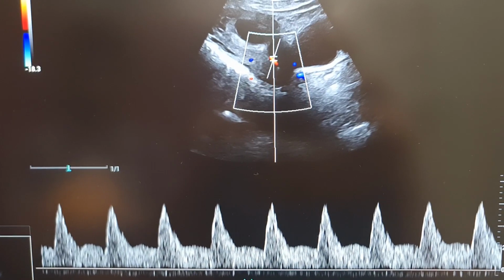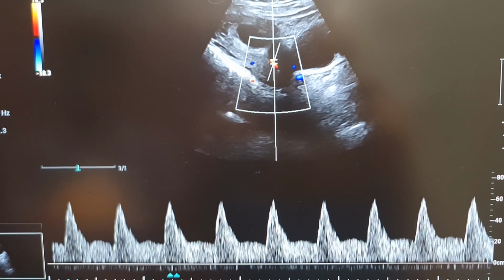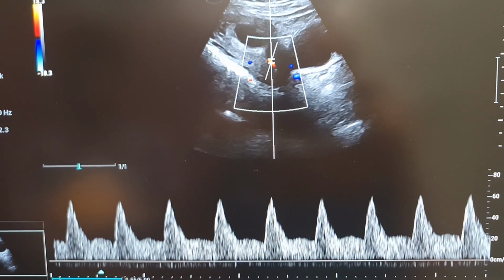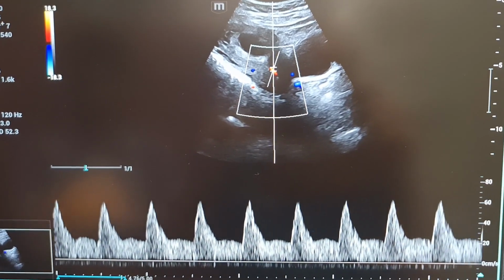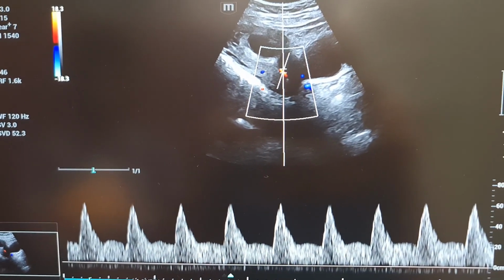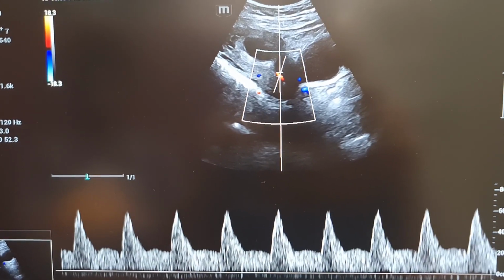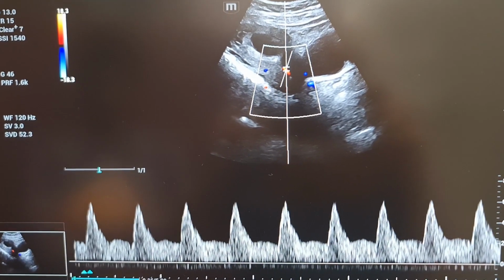Once the uterine artery is seen, now we switch on the pulse Doppler, put the gate on the vessel so as to include only the artery and obtain a good clean waveform. Remember, we have certain Doppler settings to be kept in mind, specifically the angle of insonation, which has to be between 20 to 30 degrees.